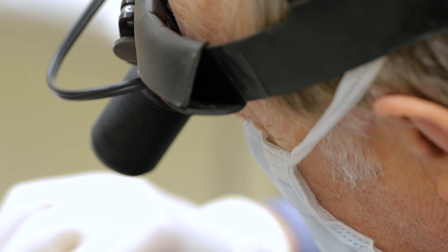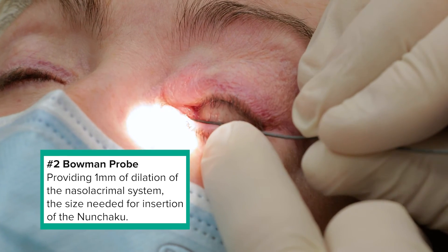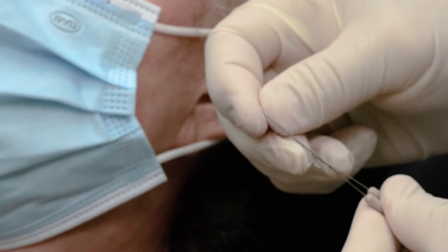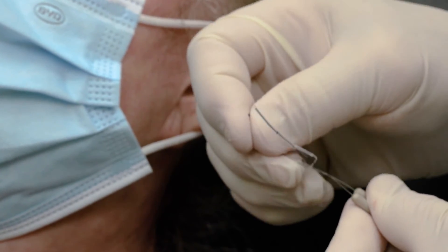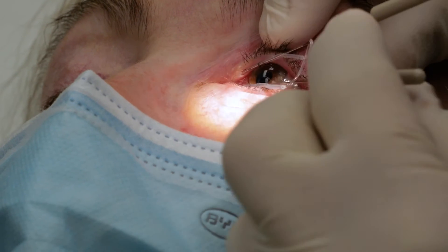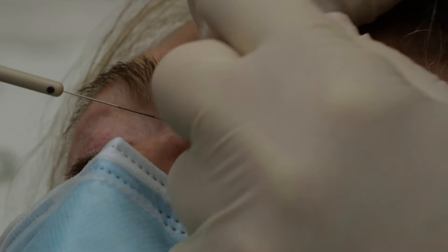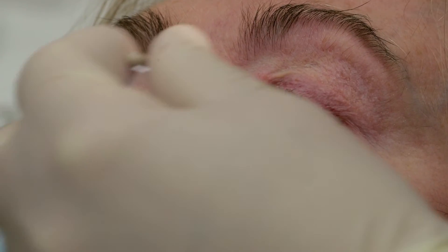After I open any canalicular strictures that are there, I like to make sure that they're open to the size of a number two Bowman probe. This is the size of dilation that's necessary in order to be able to pass the intubation device. I've now gotten out the Nunchuck U device. You can see as I introduce the stent, I advance it all the way into the lacrimal sac. I put the lower one in, now I've put the upper one in. I will grasp the lid and the stent with blunt forceps so that my stylet does not pull the stent back out.